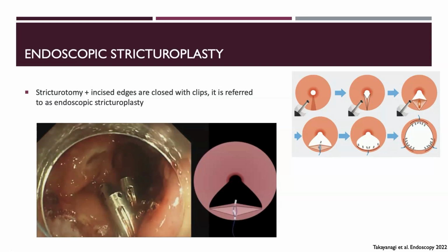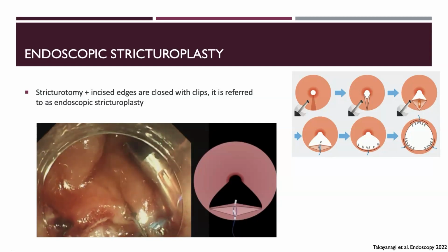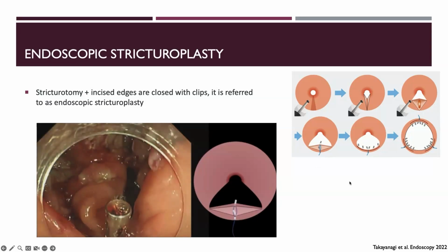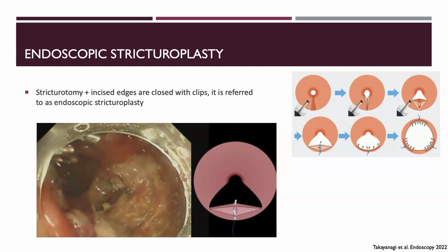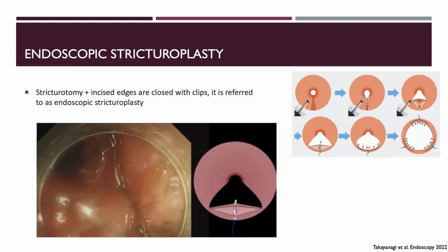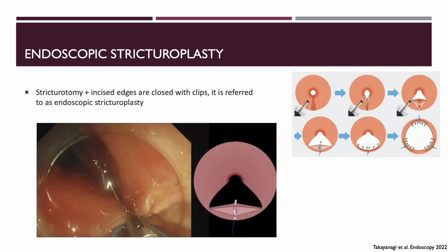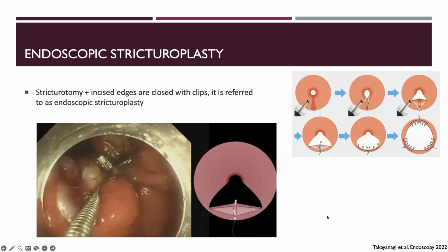Again, you have to be very comfortable with cutting and comfortable with closure because it can get very crowded in this area, but it's a great option for patients, especially for patients who have IBD and really fibrostenotic disease. I would hesitate to do this in the small bowel. This is great for the colonic strictures or the anastomotic strictures, but I would just be careful doing it in the small bowel, not to say that it's not being done. It is being done at centers of experience.